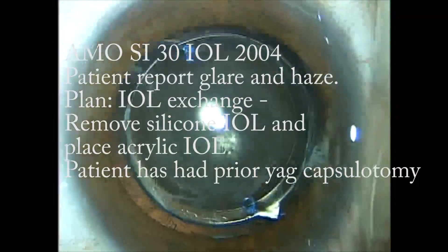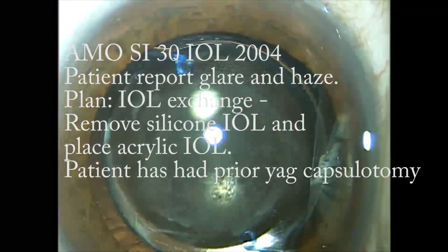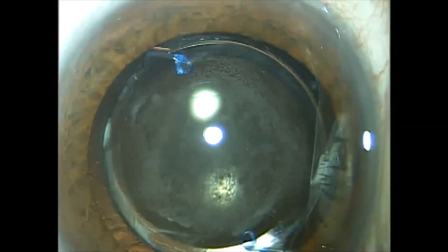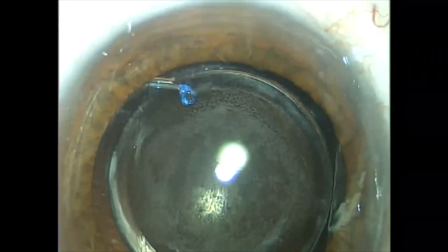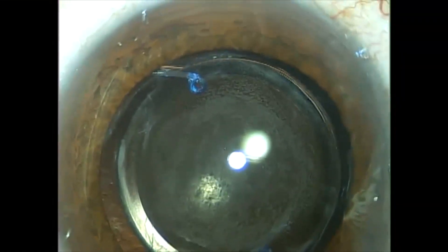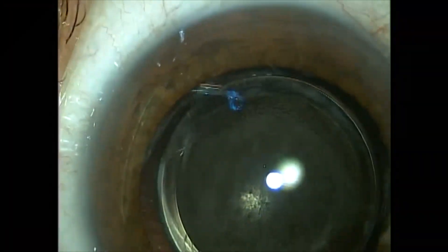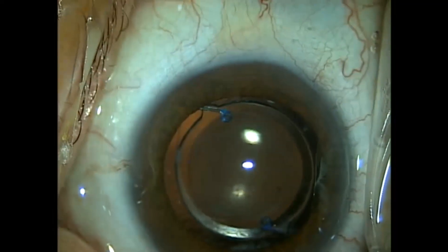This gentleman has calcium deposits adherent to the posterior surface of his silicone lens implant. He had cataract surgery with an AMO SI30 silicone lens implant, a three-piece lens placed in 2004. He came in and I did a YAG capsulotomy on his eye maybe about two years ago. He just had persistent calcium that was adherent to the posterior surface of the lens.